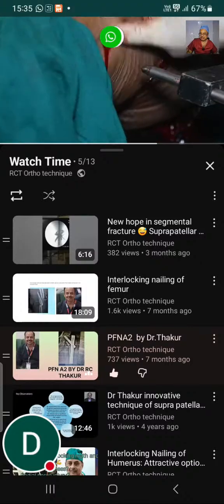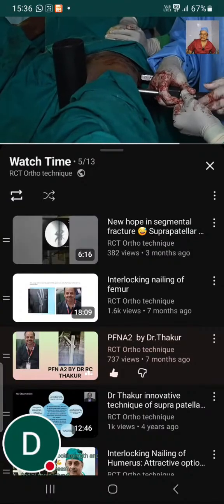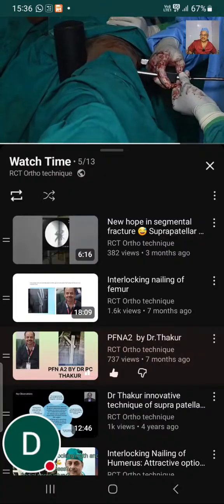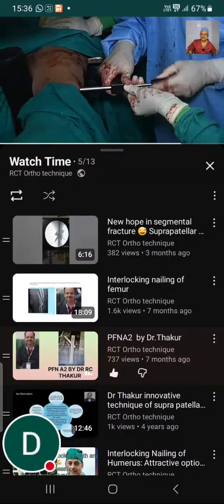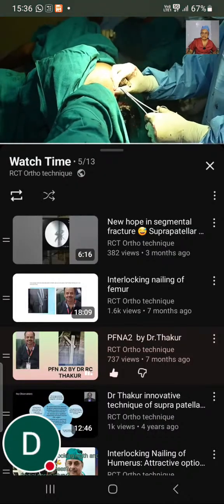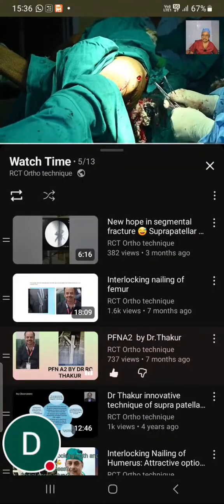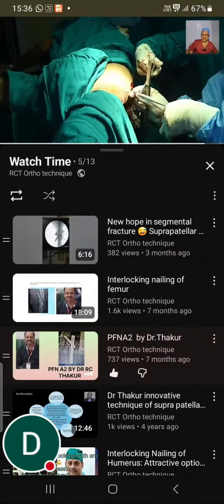And this is confirming in C-arm picture. The wound has been closed without any drain.